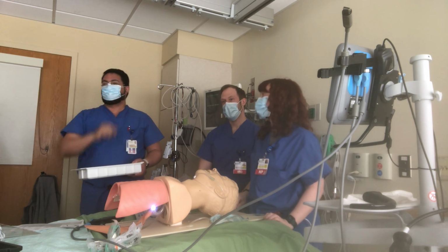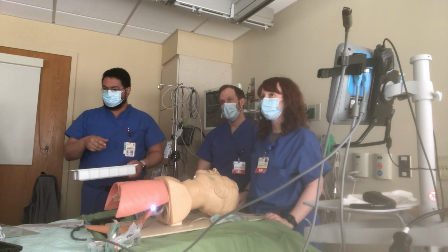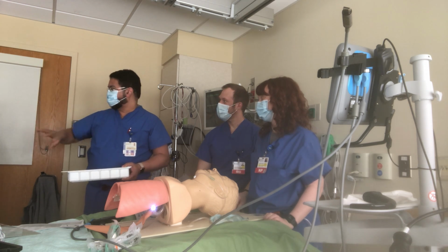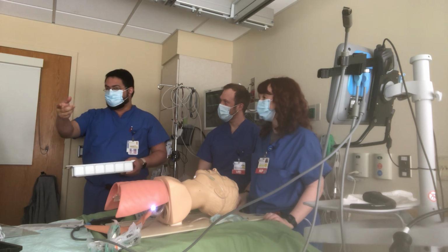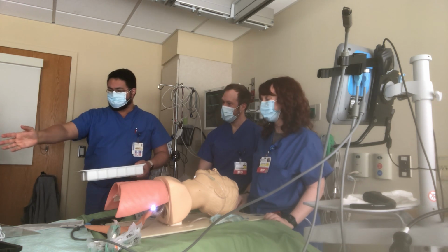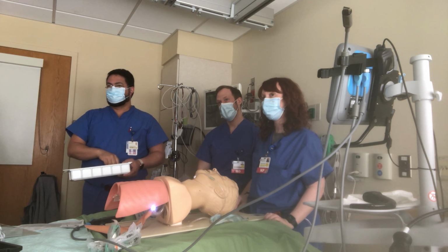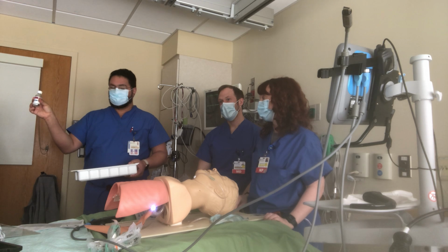So in 20 minutes, what are we gonna do? Reglan 10, Robinul 0.4, ETT in warm water. So we put the ET tube in warm water. First nuke some water there and put it in, and then the Reglan to move things down, and the Robinul to dry the secretions. Next, 10 minutes: 4% lidocaine neb, cetacaine spray.